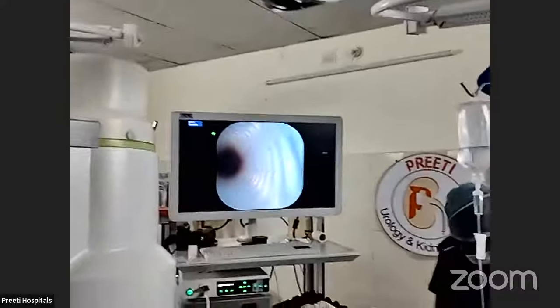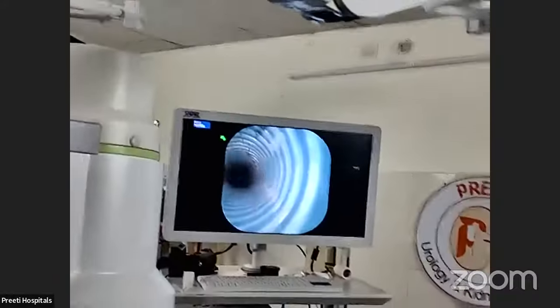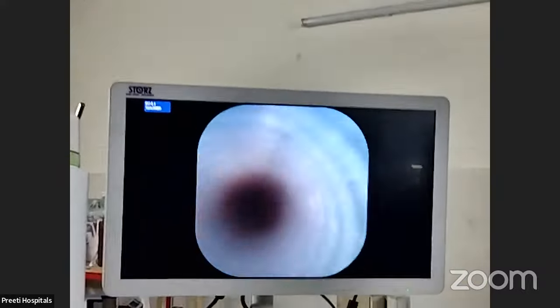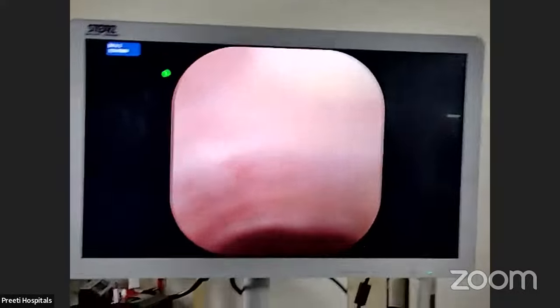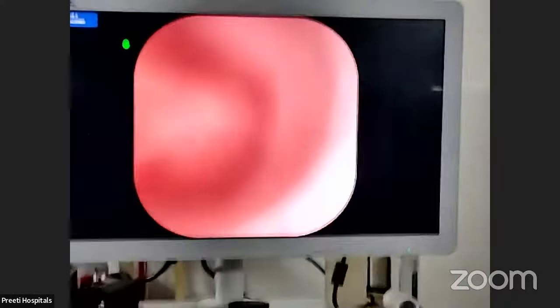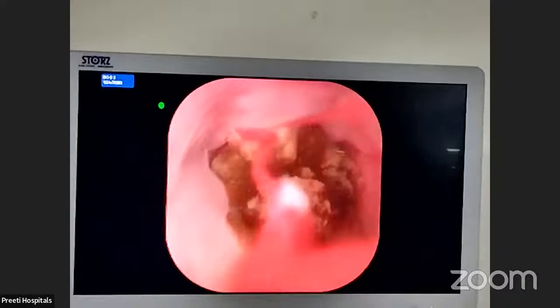His penis is also long. Water, please. Hold it, see that. Always you have to hold it straight. So we will go inside like this, inside the kidney. Now you flush the water. After some time we will see. The only thing is that we may not be able to get the sheath into the, see, this is the upper calyx stone, infundibular stone.